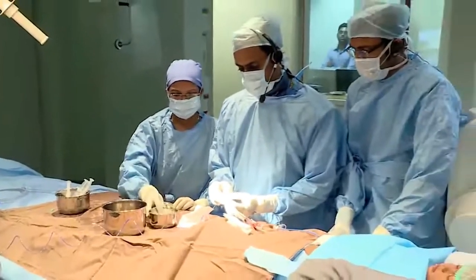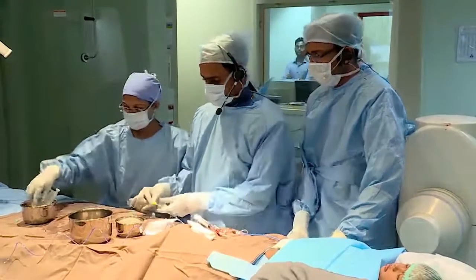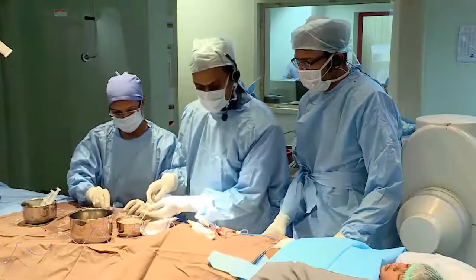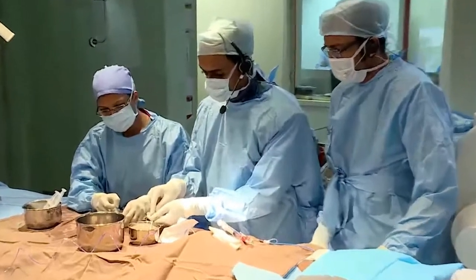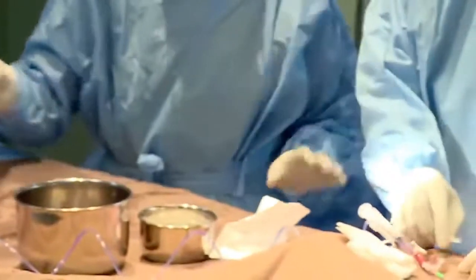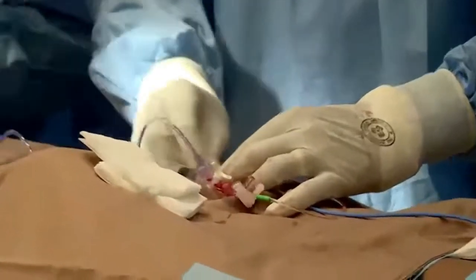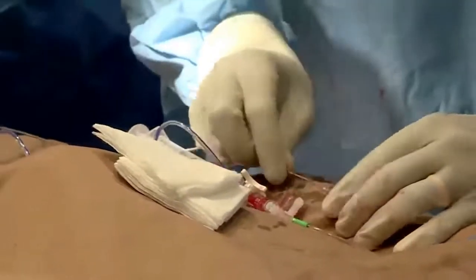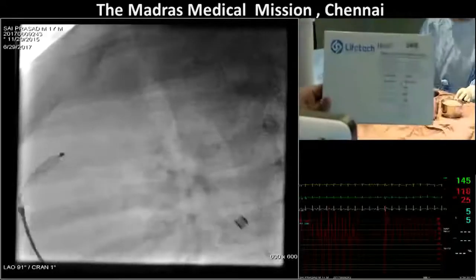Omar, you said you would as well, or not? So we occasionally go only venous, especially when we have young children, and young means less than 5 kilo. But what I like to do is to go in the PDA anterograde with a pigtail catheter, so I get a better picture of the PDA. And if I cannot get a good picture, then I use the echo to give me some idea about the form and measurements of the PDA.